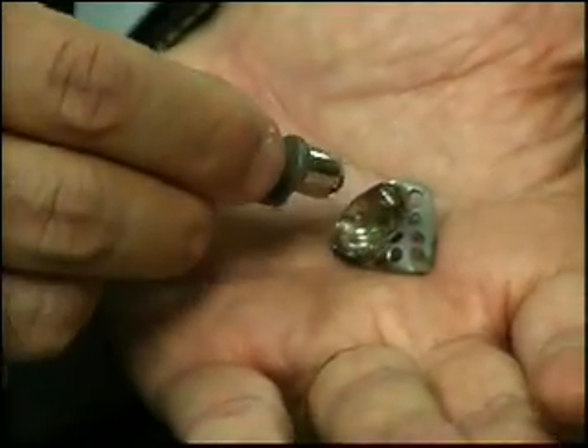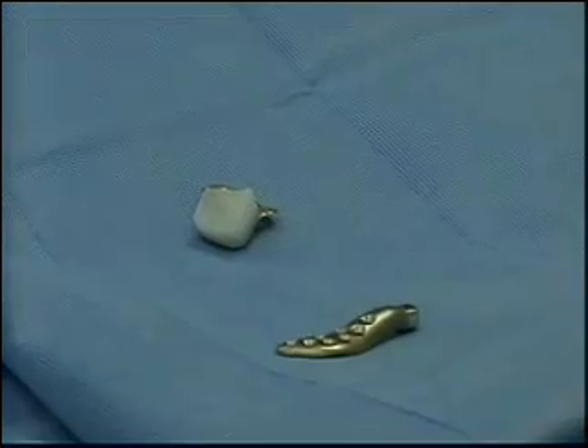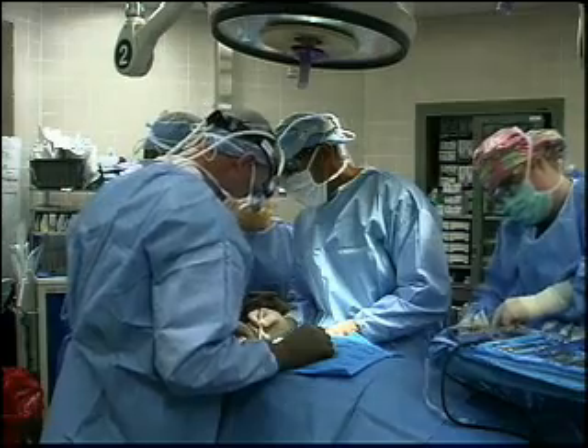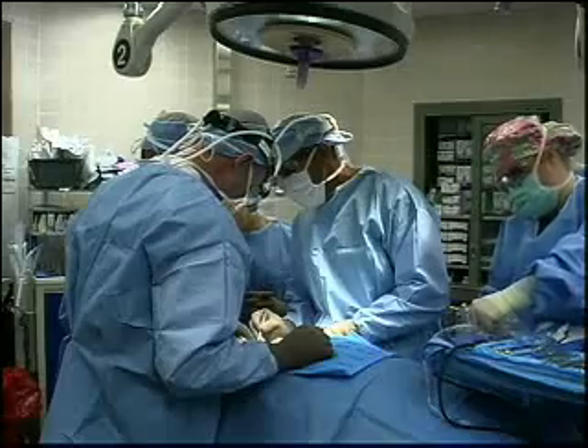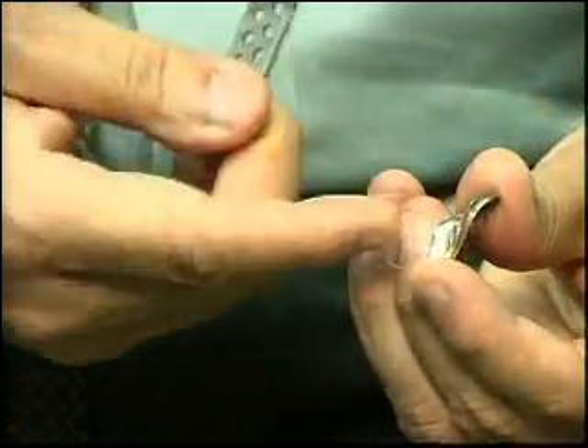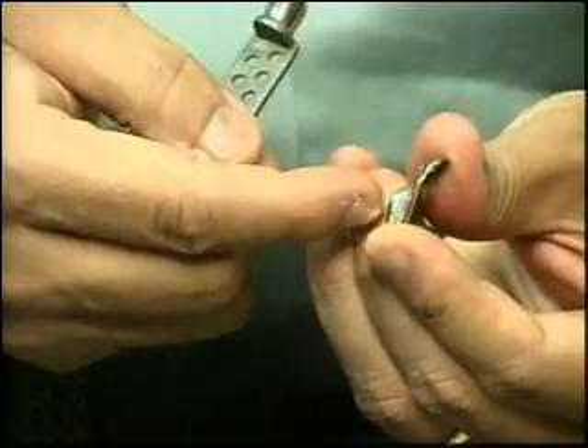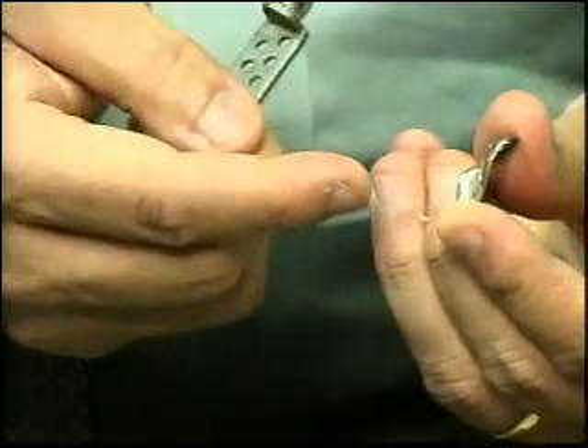The two major designs of TMJ implants are metal against metal and metal against polyethylene. Both wear over time, increasing the likelihood of revision surgeries. The mechanical wear actually happens because of this sliding motion, and as a result, metal particles get loose from the surface.